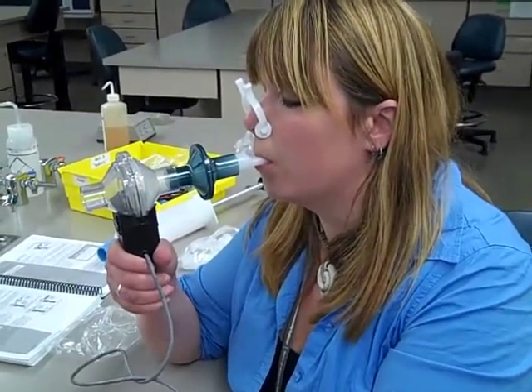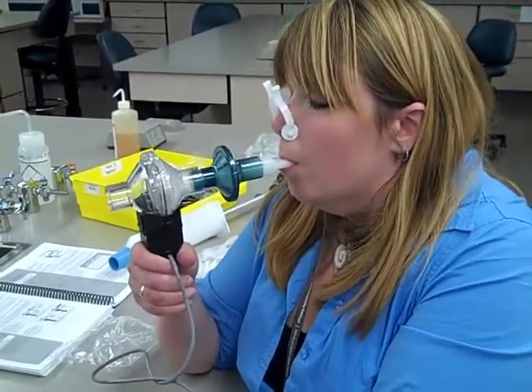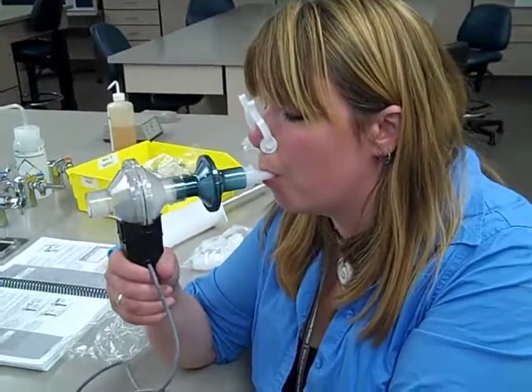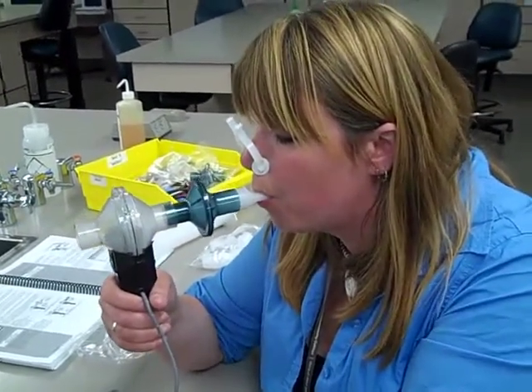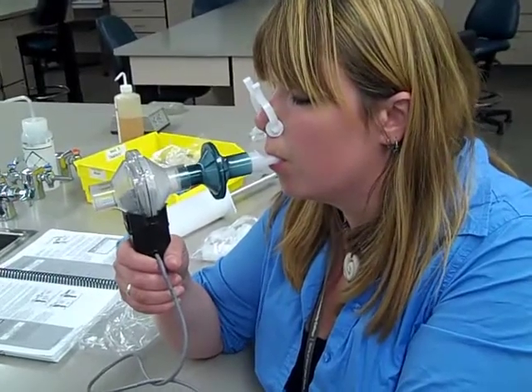So ready, set, deep breath, deep breath, deep breath. And blow it out, blow it out, blow it out. All you can, all you can. Good. Now breathe regular. Stop.